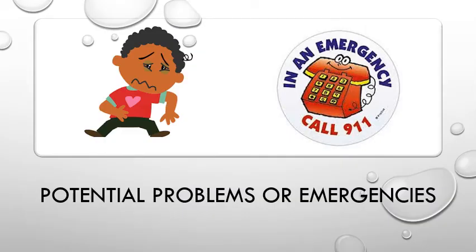Report any symptoms of distress, such as nausea, vomiting, breathing problems, choking, abdominal or chest pain, coughing, or fever to the licensed delegating nurse immediately and stop the tube feeding. These symptoms may indicate a potential problem and continuation of the feeding may be hazardous. Vomiting may lead to stomach contents getting into the airway and causing breathing problems or distress. If breathing problems occur, stop the feeding immediately and call 911.